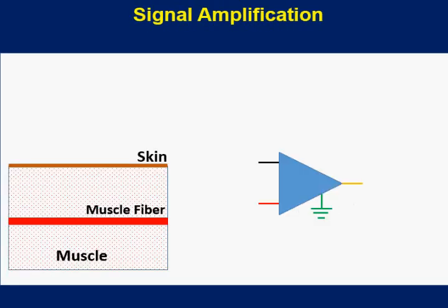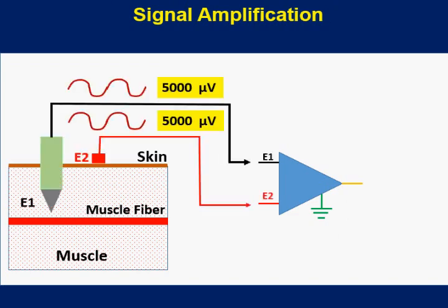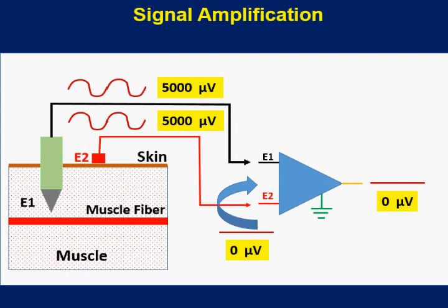Note that the ambient noise is same at E1 and E2 electrodes. When subtracted, we get zero voltage, and hence the signal does not appear at the amplifier output. In this manner, the differential amplifier has managed to amplify the low voltage fibrillation while attenuating much higher voltage noise.